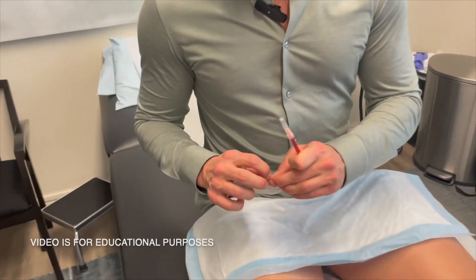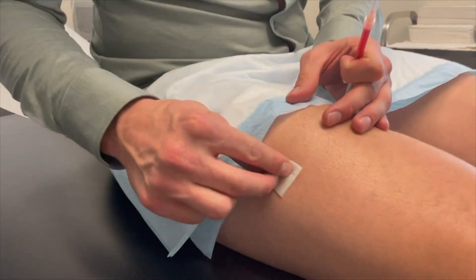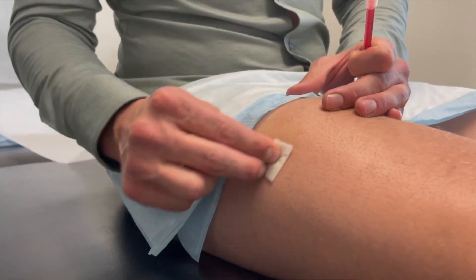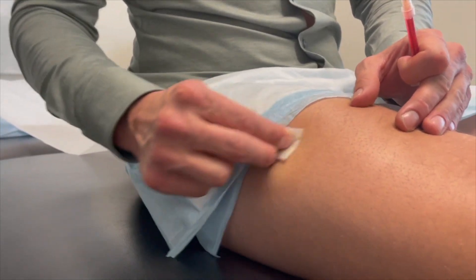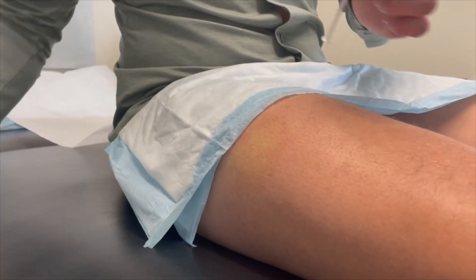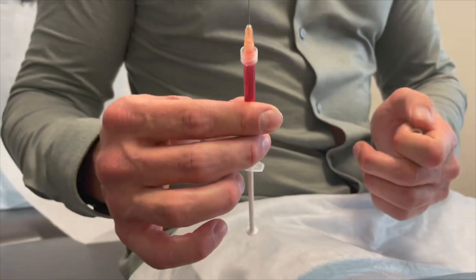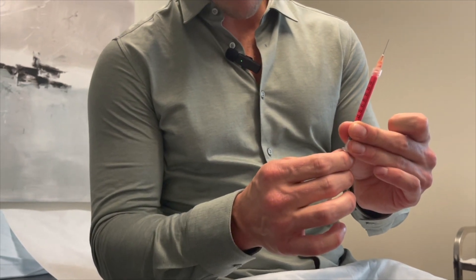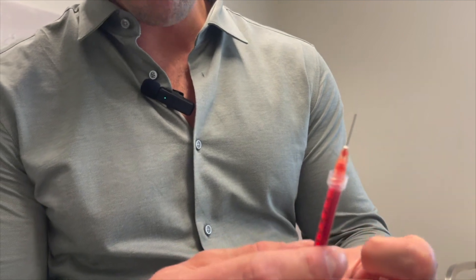I'll show you how to intramuscularly inject. The first step is to clean off the injection site. For this example, we'll be injecting into the thigh. You have three options for injecting — typically the thigh, the glute, or the shoulder. When you inject in the thigh, you're just coming off center to where your femur runs. After cleaning off the site, remove the cap of the needle. Double check to make sure there are no air bubbles inside the syringe — you can push the plunger up until you get a slight bubble of medication at the tip.